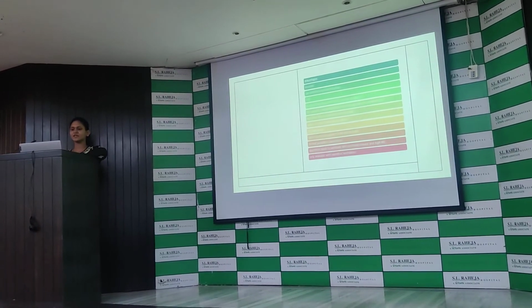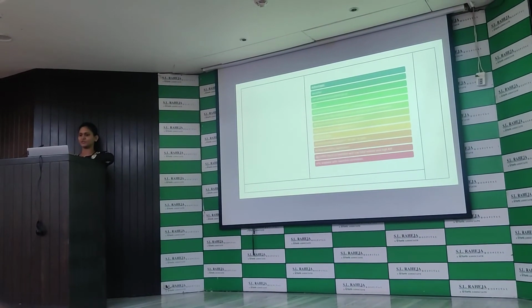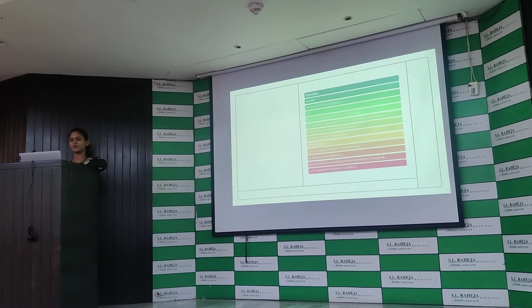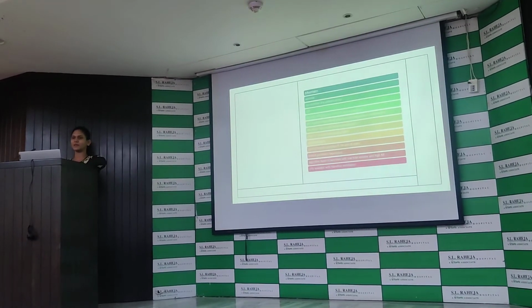The disadvantages are that you cannot directly program the tidal volume, respiratory rate and I:E ratio. There is limited pediatric experience. The algorithm tends to ventilate with low tidal volume and high respiratory rate. It is only available in Hamilton ventilators.